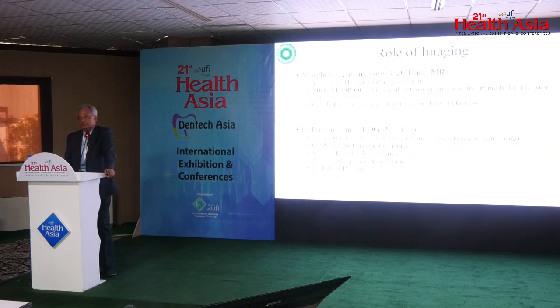The morphological imaging, which includes contrast-enhanced CT and MRI, plays an important role in T-staging because of its higher spatial resolution. MRI, specifically because of its high soft tissue contrast, plays an important role in patients with nasopharyngeal, oropharyngeal, and oral cancer. And it is considered as the modality of choice for the diagnosis of perineural extension, marrow and mandibular invasion, and certainly in patients with brain metastasis, where FDG PET-CT has limited sensitivity due to the presence of normal enhanced FDG uptake in the brain cortex.